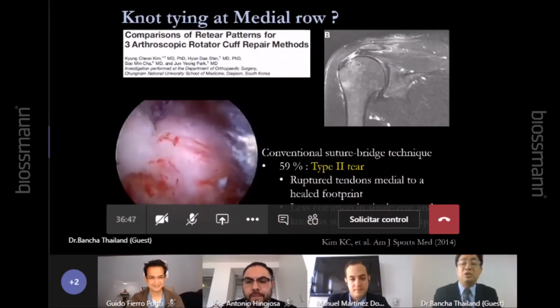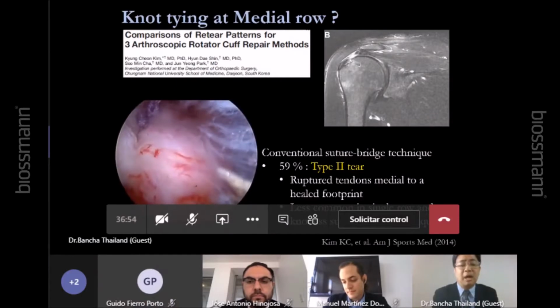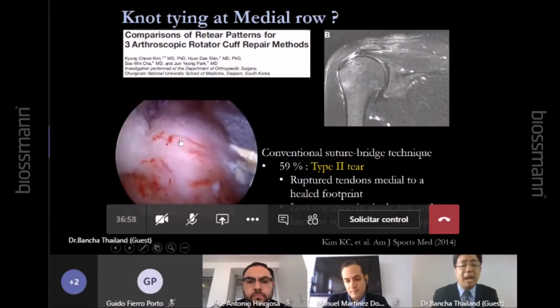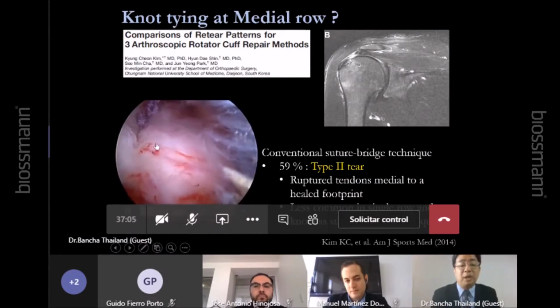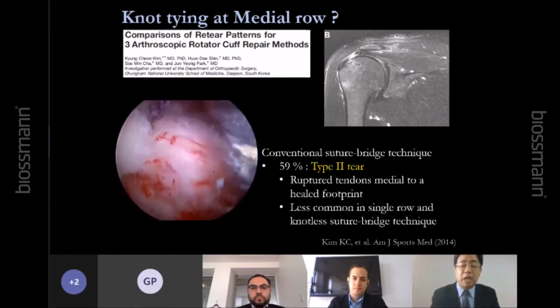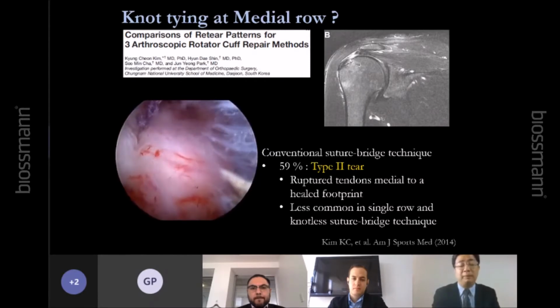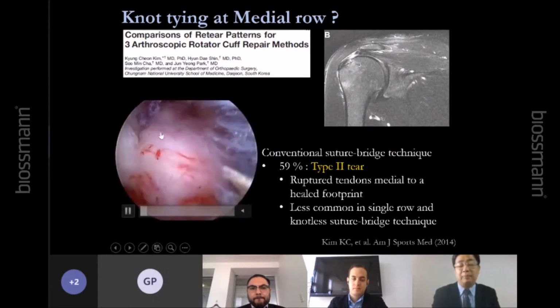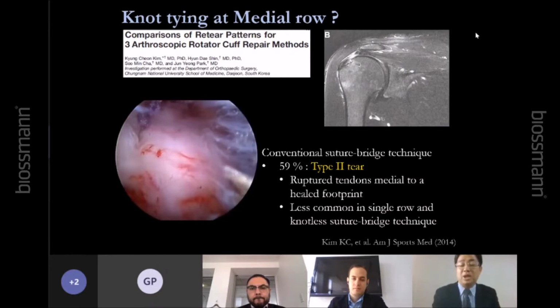So this article changed my techniques of rotator cuff repair. We found that many of the patients have come back with a torn rotator cuff after the knot tying. You can see from this video the vascular obstruction by the knot tying. That's why there is a report mentioned about the type 2 tear or musculotendinous tear after the knot tying, conventional suture bridge technique, right? Because of the vascular strangulation, and the tear is always at the knot tying level. So this problem is less common in single row and knotless suture bridge technique, right?